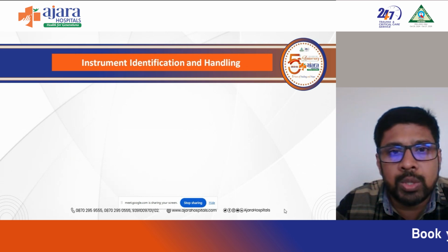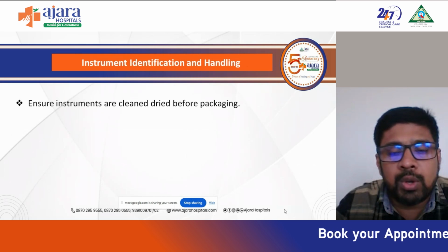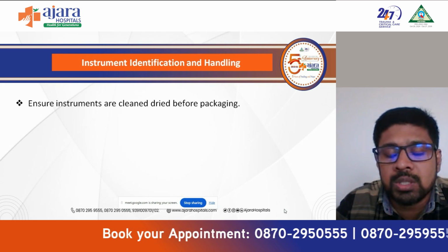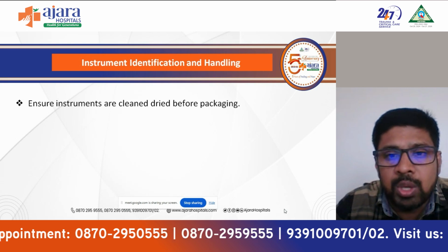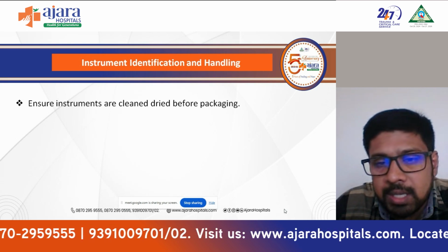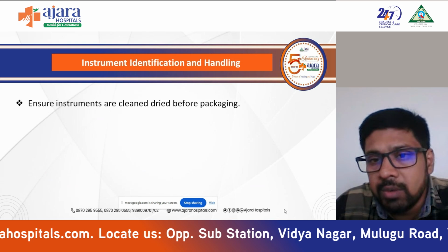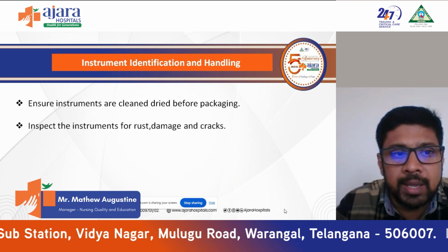Then we'll move on to instrument identification and handling. Before packing, we need to identify that the instrument is cleaned properly, dried, and has undergone all the processes before coming into the package. What are the processes we follow before packing? One is receiving, then disinfection, then washing, drying, and examination. And if any repair is needed, it will go for repair. This process we need to ensure before packing.